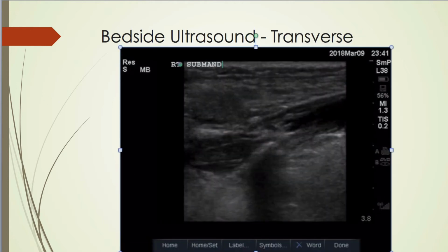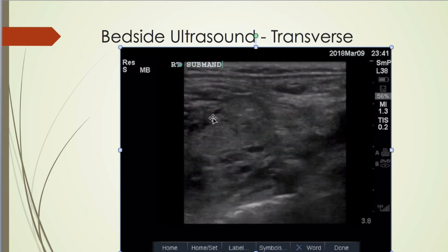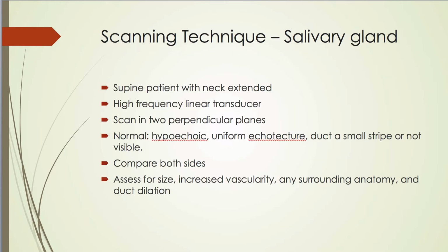The transverse view of the gland is shown here. Again, you can see inflammatory changes and some ductal and hilar fullness. So when would you think to do a salivary ultrasound?